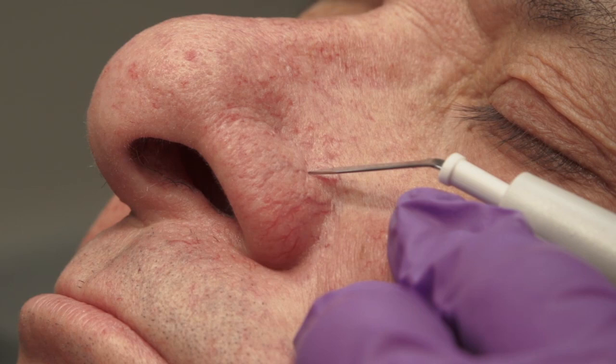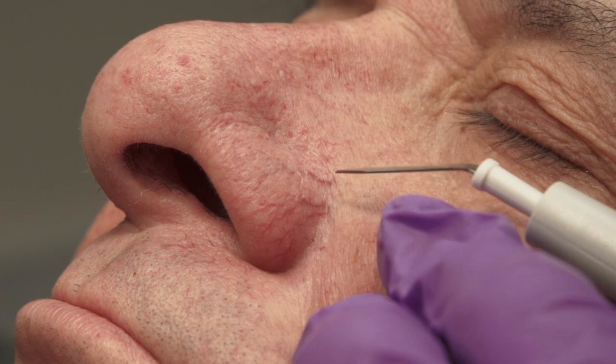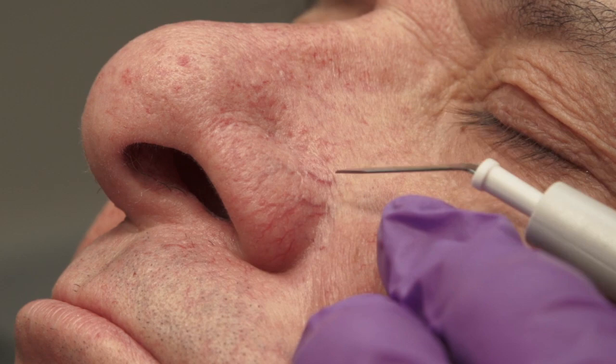Electrosurgery is a versatile and powerful tool in the treatment of many skin lesions. Access to and knowledge of electrosurgery will expand your repertoire of skin treatments available for your patients.